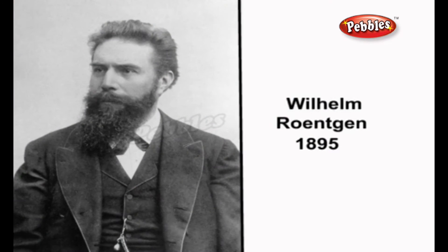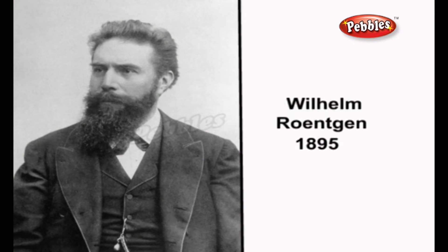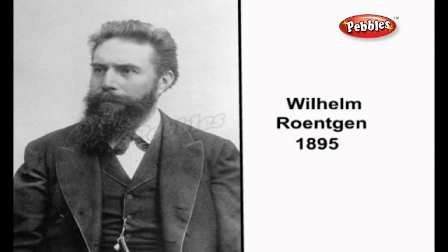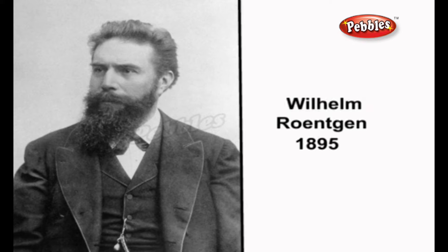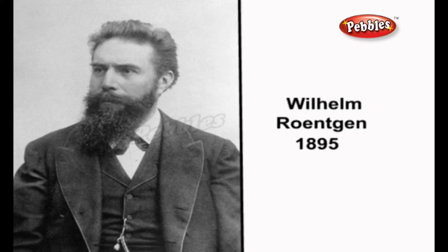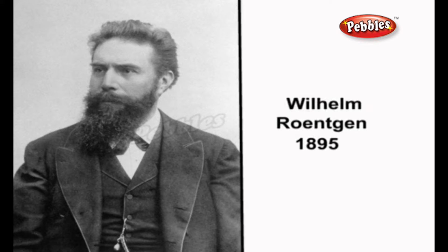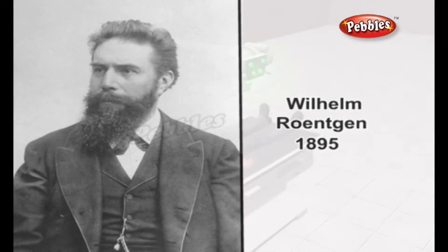X-ray technology was invented completely by accident. In 1895, a German physicist named Wilhelm Röntgen made the discovery while experimenting with electron beams in a gas discharge tube.